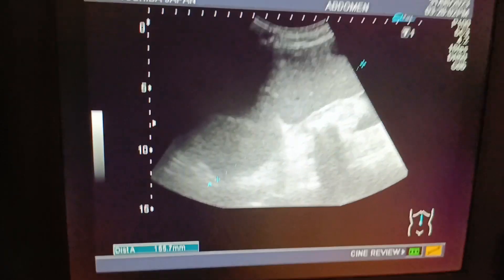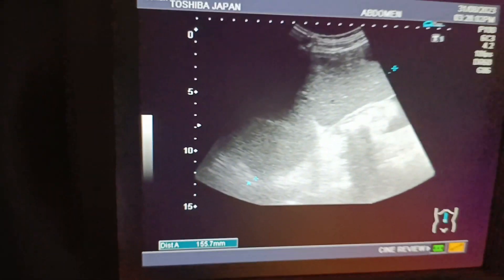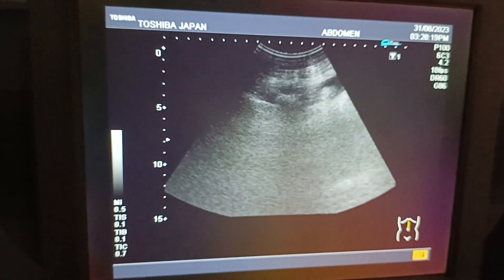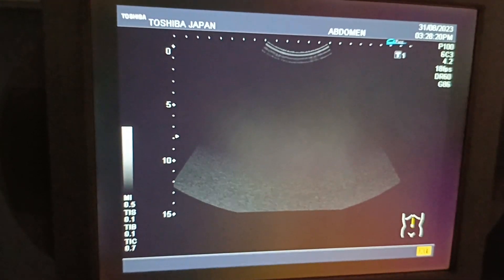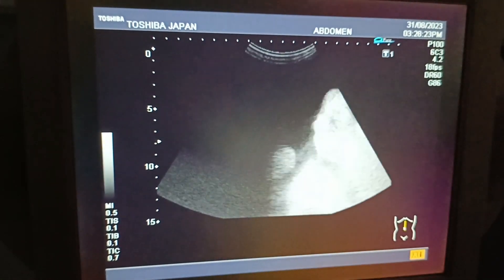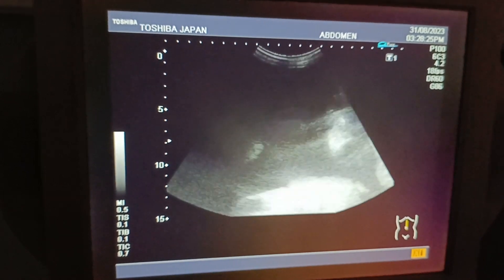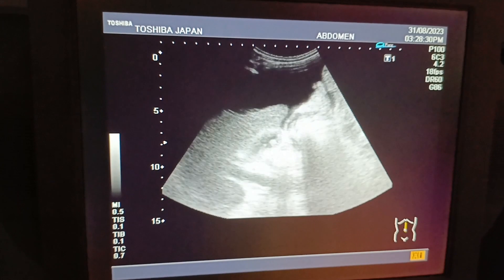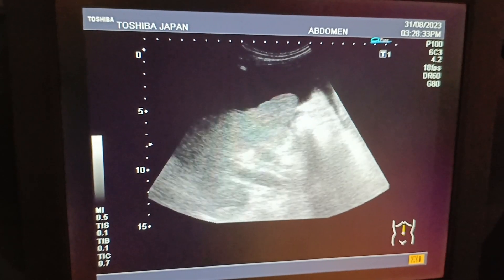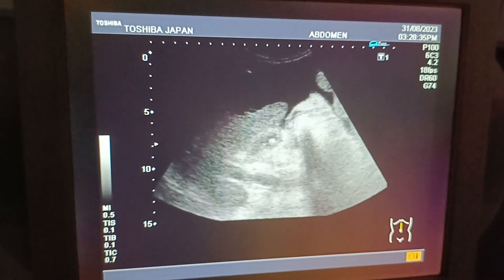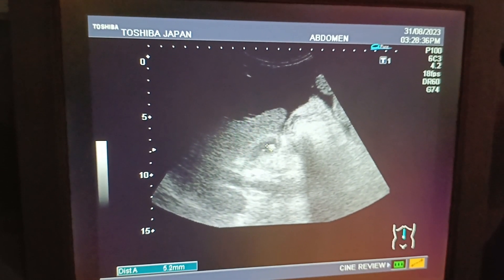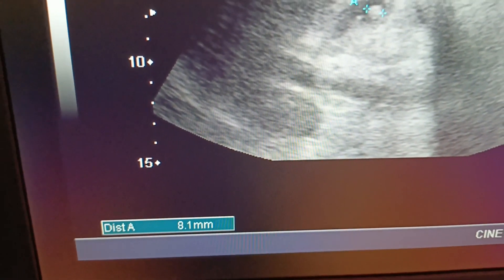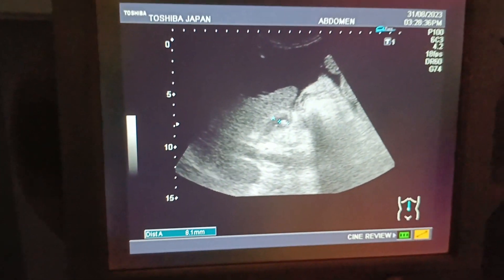On the left side there is massive splenomegaly with an engorged vessel in the hilum of the spleen. On the right side, the gallbladder contains multiple stones with a thick wall, pericholecystic fluid is also present.